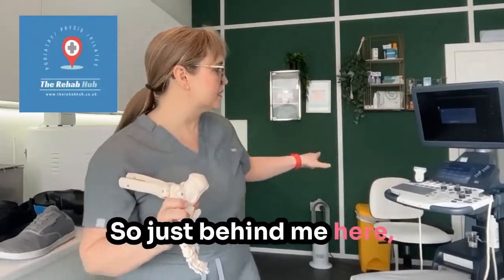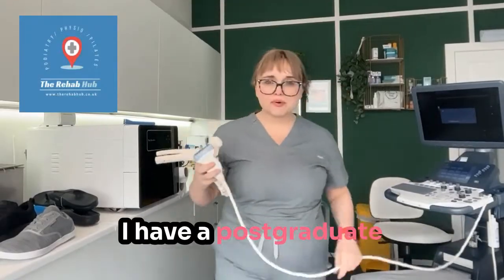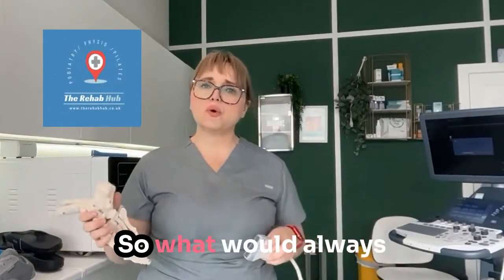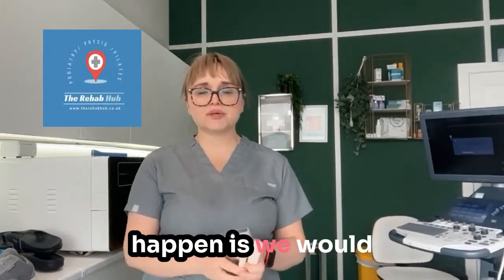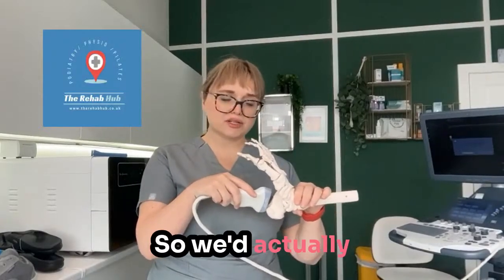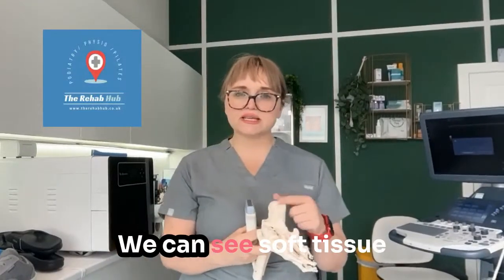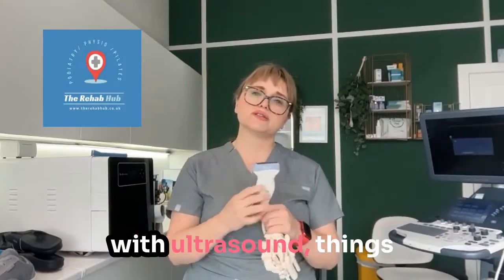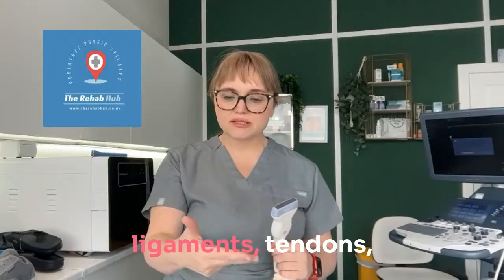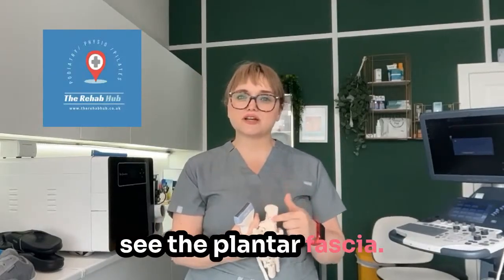So just behind me here, this is a diagnostic ultrasound scanner. I have a postgraduate certificate in diagnostic medical ultrasound. So what would always happen is we would utilise this and we would scan your foot, so we'd actually see what's going on inside the heel. We can see soft tissue with ultrasound, things like fibrous tissue, ligaments, tendons, bursa. We can actually see the plantar fascia.